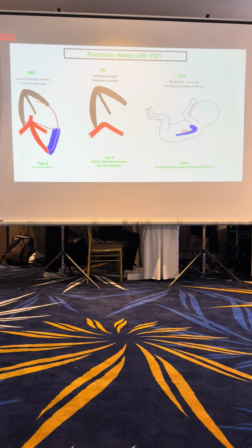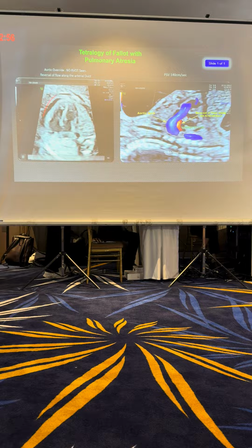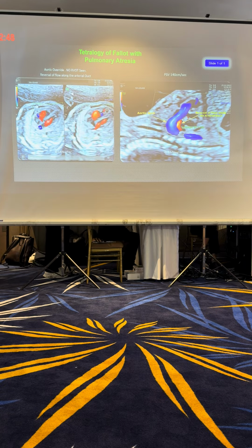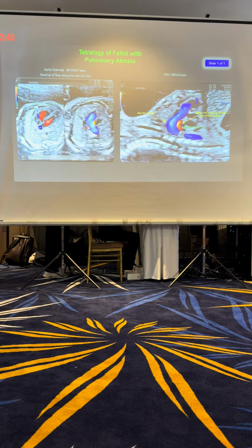And then this baby comes off the descending aorta. On ultrasound, you do a 4-chamber view of the heart, there's a left descending aorta, and you can see there's a VSD, and you can see that there's aortic override. You then sweep up, and you get the aorta, and then you can see the reversible flow. The thymus, the trachea, the transverse aortic arch, the SVC.